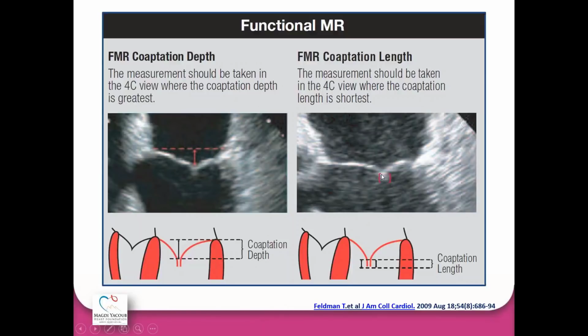On the other hand, the anatomical criterion which is still holding till this moment is the coaptation length, which is the actual coaptation between the two cusps. We have to have at least 2 millimeters of coaptation between the two leaflets, because this coaptation will help the leaflets to fit inside the clip during the grasp. If they are too far away from each other, it will be too difficult for the small clip to grasp them both at the same time.